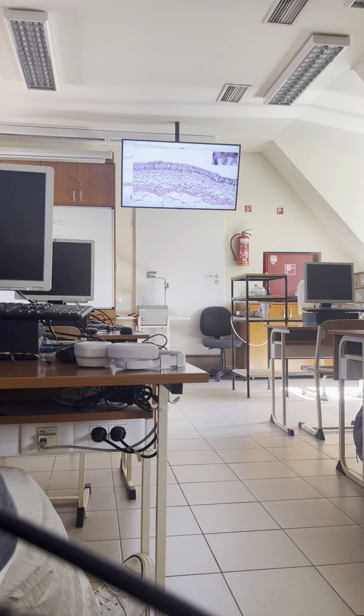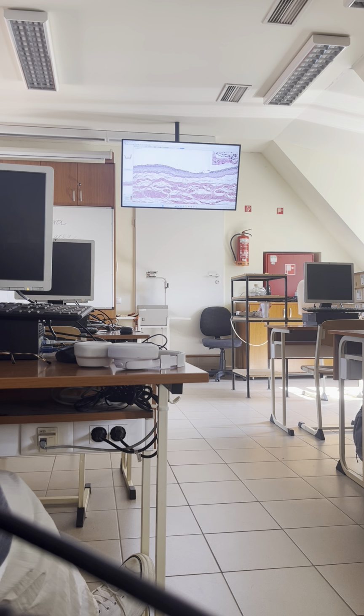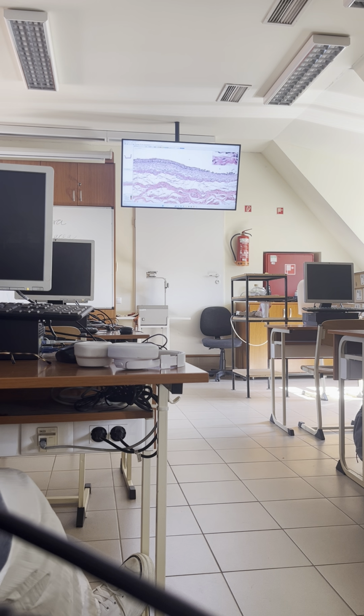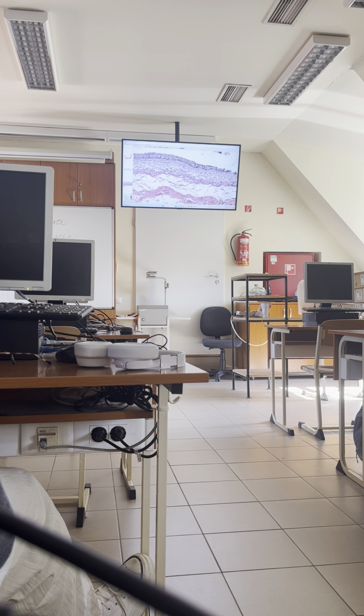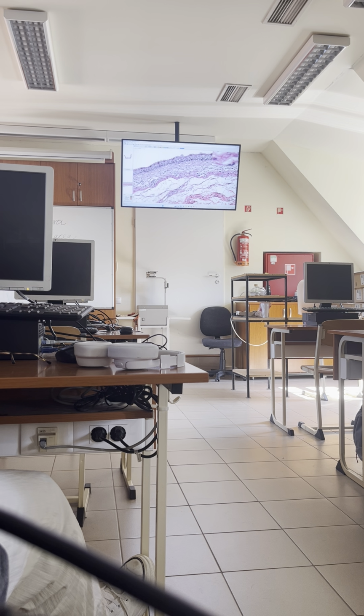And below the row of piriform cells, resembling the shape of pears, the fruit. And here you can see the lamina propria, no muscularis mucosae, no submucosa. Although, if you look at this lamina propria, you can easily realize that this upper portion of this connective tissue is looking different than this lower portion. So the color is different.